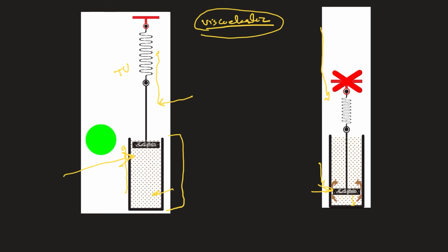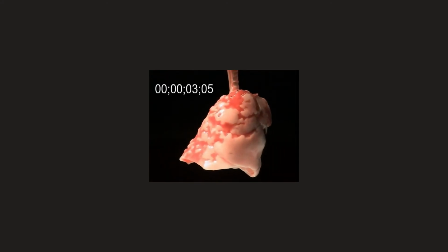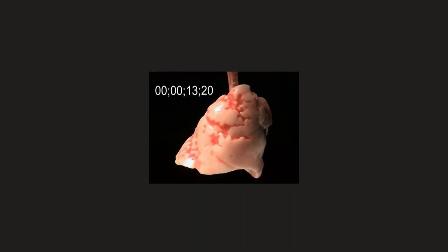I'm going to show you one more video, the last video, to make things very clear, and then I'll explain to you why I'm showing all these videos. Okay, I'm going to play this video now. Look how long the alveolus takes to recruit. If you keep going with this video, it probably takes up to 30 seconds. Now it's recruiting slowly. So the tidal volume was delivered, but it's slowly recruiting, as you see, this whitish stuff.